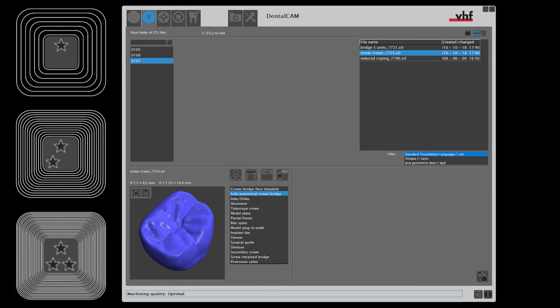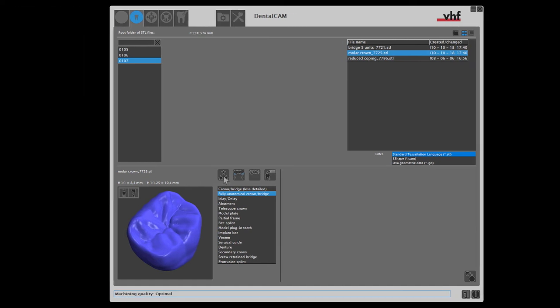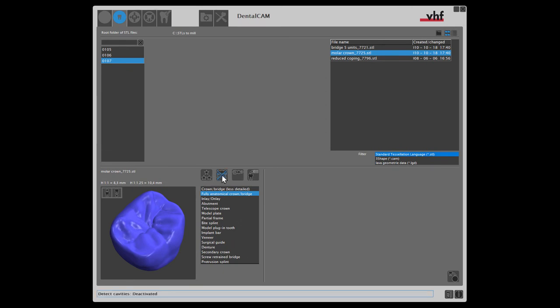The surface quality of the cavities is not affected by this setting. With this icon you can deactivate or activate the feature detect cavities. If we activate the feature detect cavities, the software will automatically detect the cavity of the crown, including the preparation line.